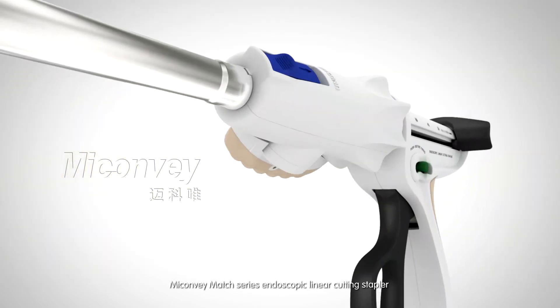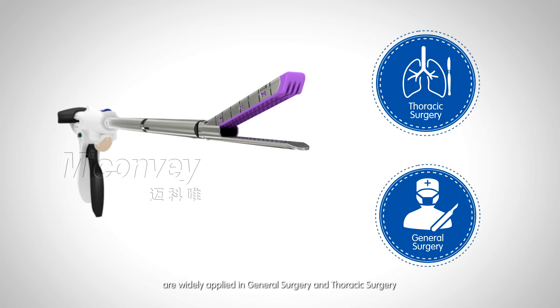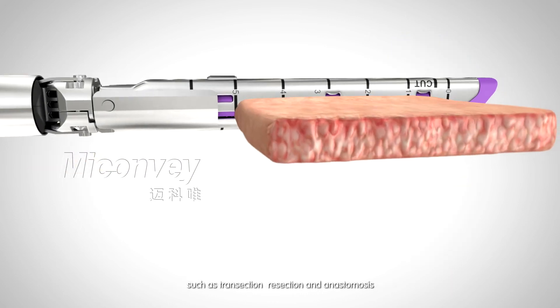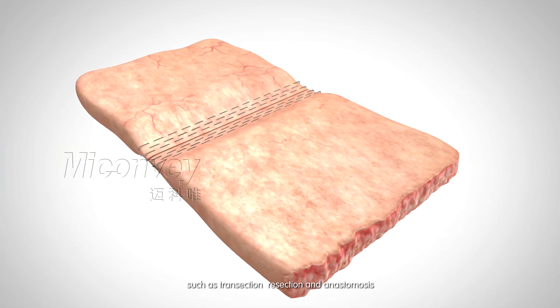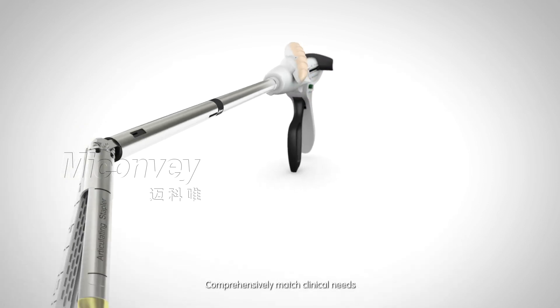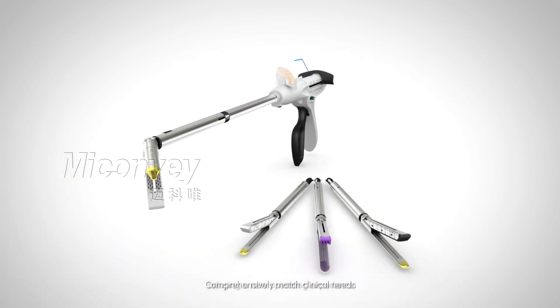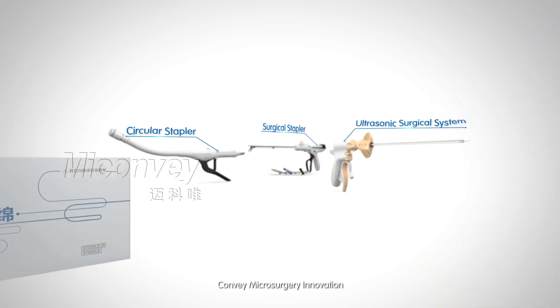Miconvey Match Series Endoscopic Linear Cutting Stapler is widely applied in general surgery and thoracic surgery, such as transection, resection, and anastomosis. The Match Series Endoscopic Linear Cutting Stapler comprehensively matches clinical needs, bringing a new operating experience. Convey Microsurgery Innovation.